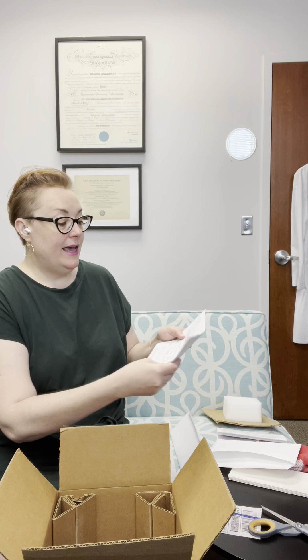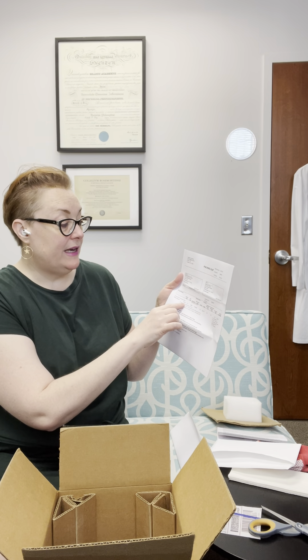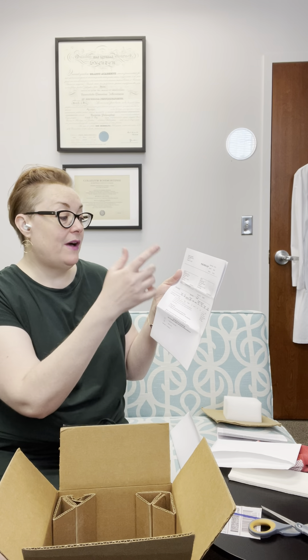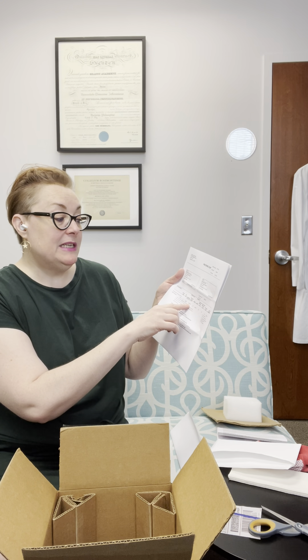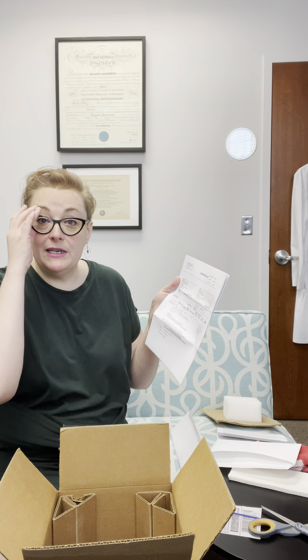The second packet is our packing slip. On the ship-to side you want to verify that it's your name and your address and everything's correct. You'll see under the product type that in this instance I've ordered one ICI vial of donor 2854 from his specimen date 11509, vial number two. This information is important because that's what you ordered, and you're going to verify that when you open your tank to make sure you got exactly what you ordered.